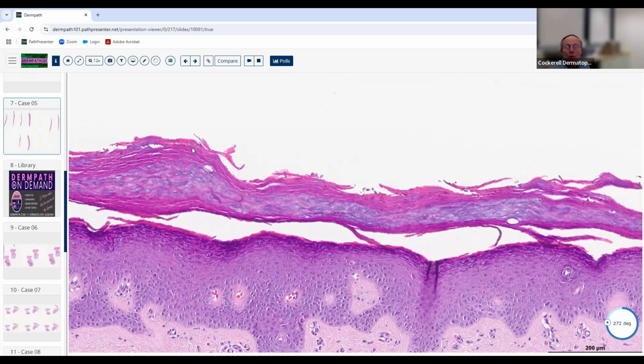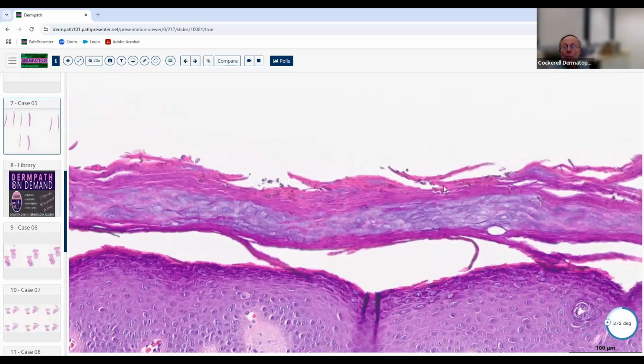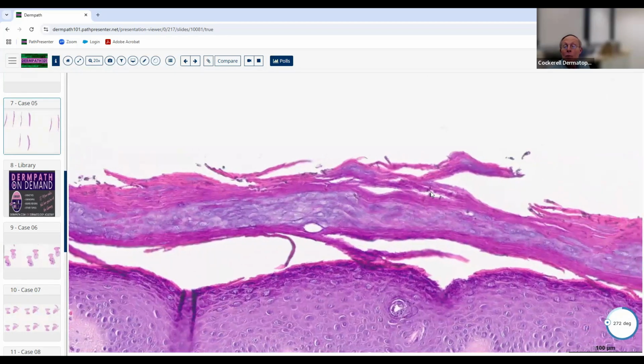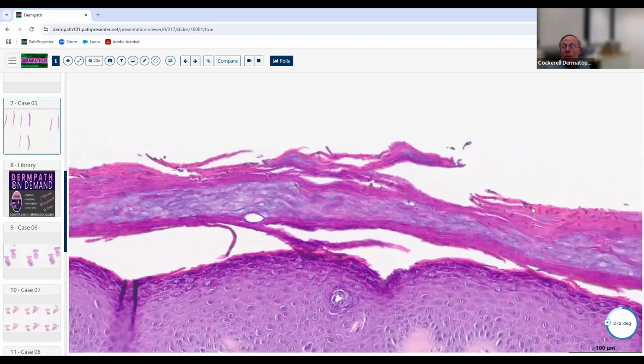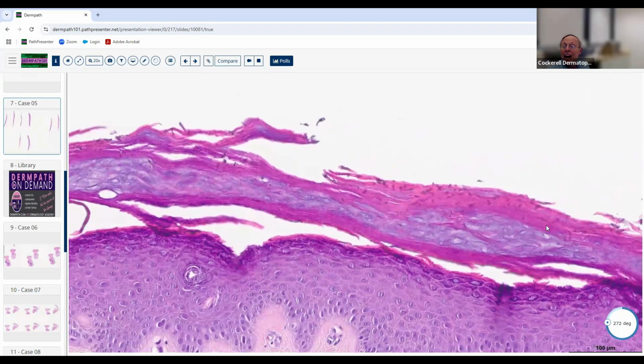That's usually a diffuse homogeneous black discoloration that goes over the whole thing, and you start seeing small particulate granules, which is the silver nitrate that's been applied to the skin. But here we see small little tube-like structures in the cornified layer, and these happen to be hyphal elements. And here you see some that are almost growing at right angles to the stratum corneum. So this is an example of Tinea Nigra.